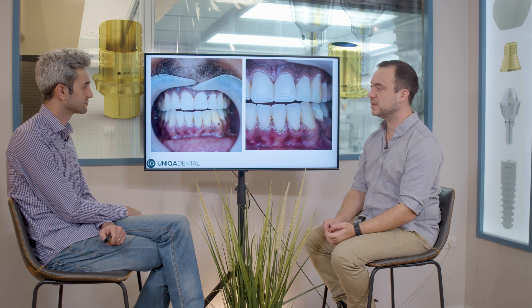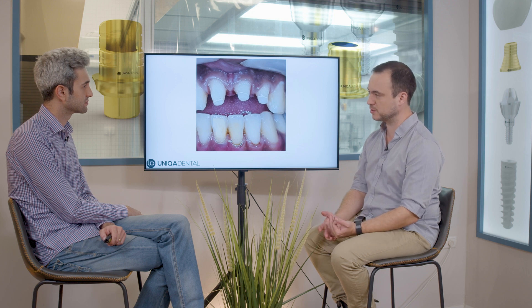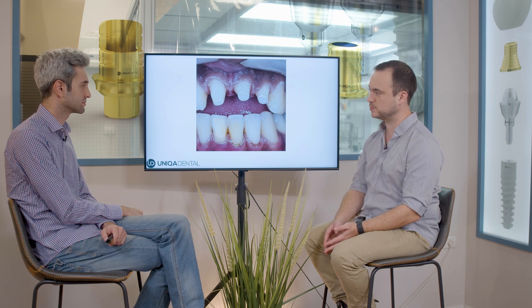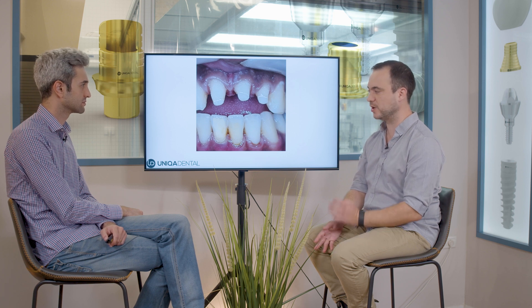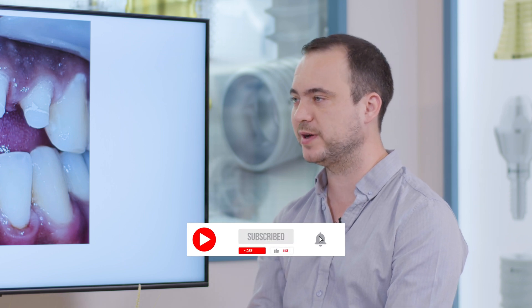After we made the provisional crowns, we took impressions again and made the post and core for each tooth separately. We cemented the post and cores, as you can see. They were also made from zirconia because you need to have a strong, esthetic post and core — you don't want metal post and composite showing through the crown, because the crowns for anterior teeth are translucent. You want all materials to be white, in the same color. In this case we used zirconia cores. You can also use composite material with a fiberglass post.